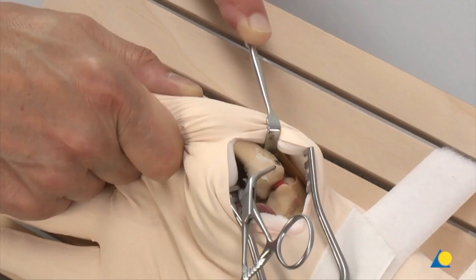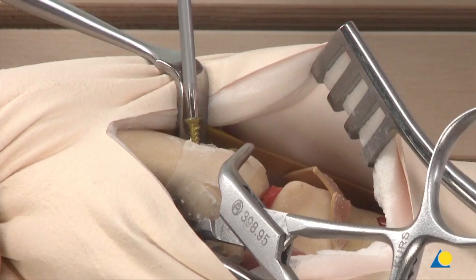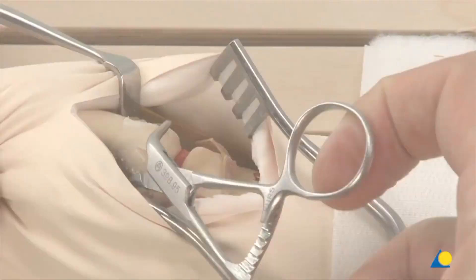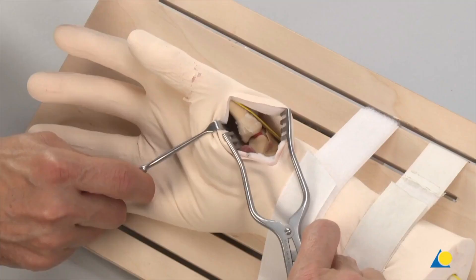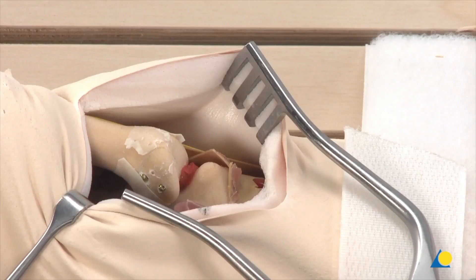The depth is measured and the screw is inserted. Good compression to the fracture can be applied by tightening both screws alternately. The reduction forceps is removed. By turning the first metacarpal bone back into place, the tips of both screws become visible, protruding from the far cortex by one to two turns of the thread. The reduced articular surface is smooth.